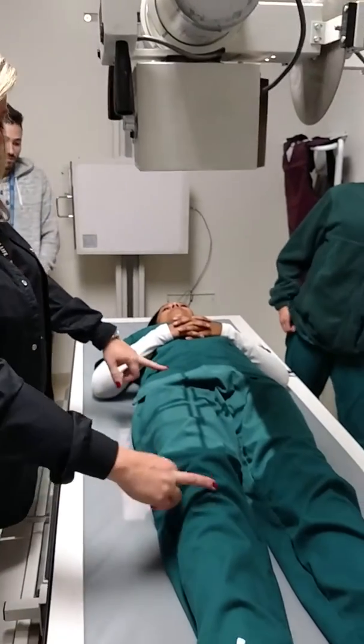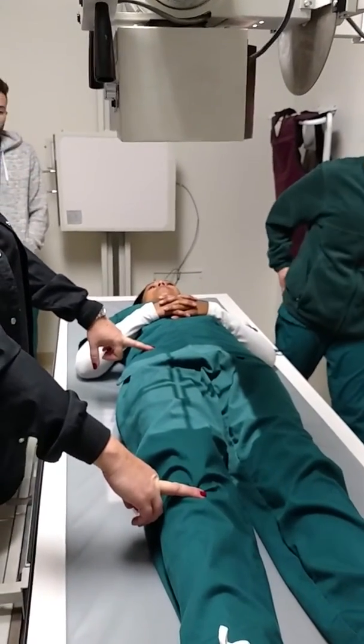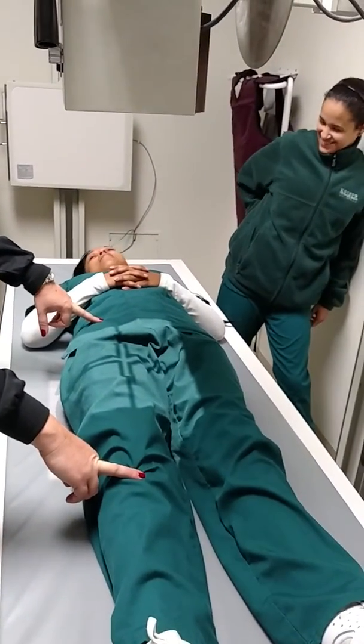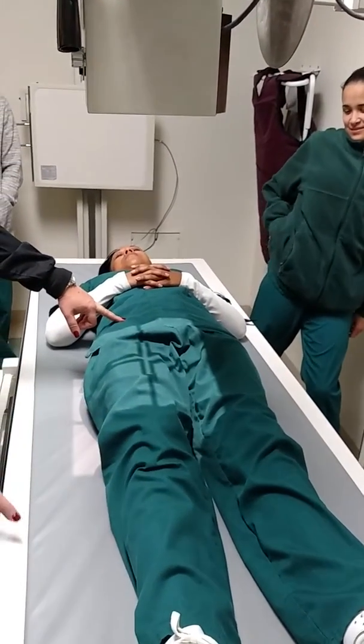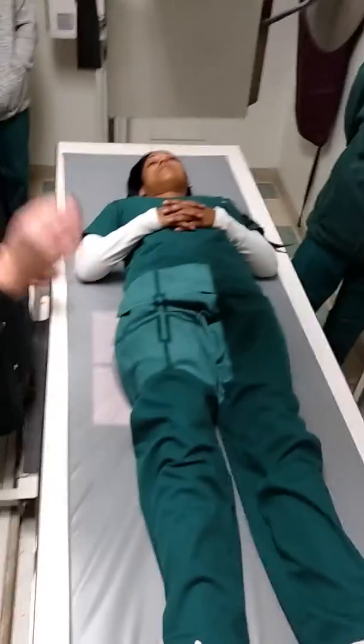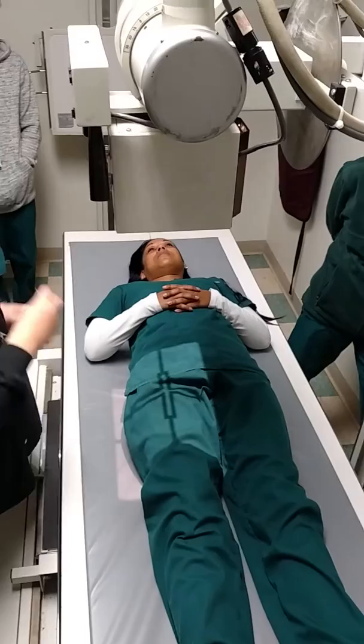She is not going to fit from here to here on one cassette. Nobody is. We even did Omaris and she didn't fit. So it's going to take 2 pictures to do 1 picture. So first I'm going to start at ASIS, so I know I have the top of the hip joint. I can show a little bit of collimation.